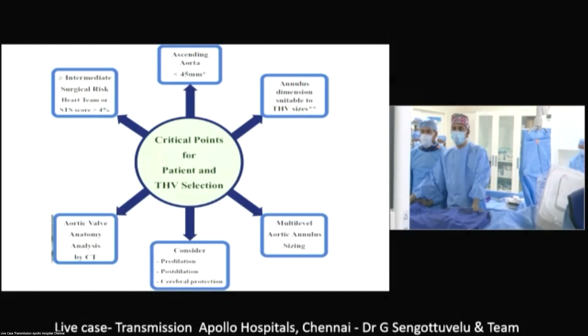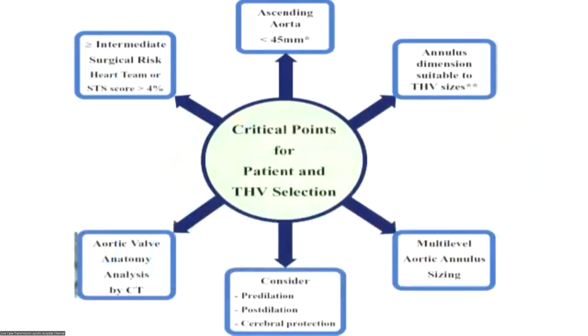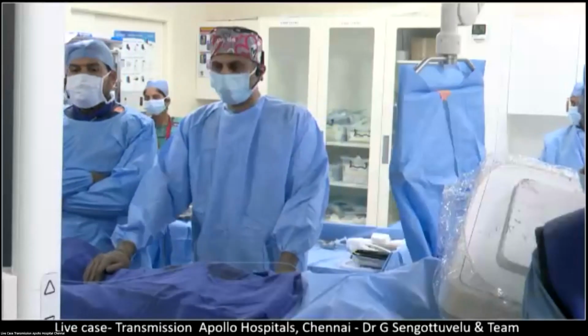Before you tell us what you decided to do, maybe it'd be worth getting some comments from the panel, because I think we saw a nice type 0 to start. Each one is very different. So maybe going down the panel, we'll talk about one critical consideration and what you would do.